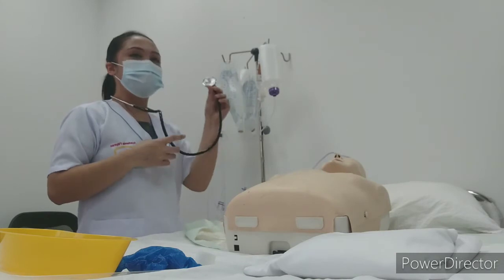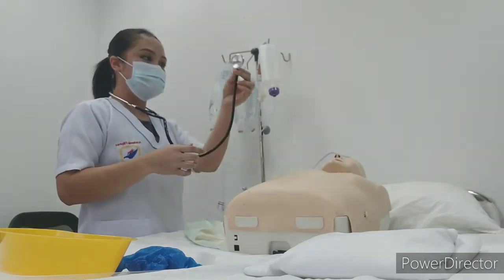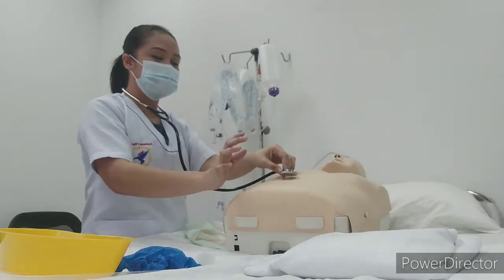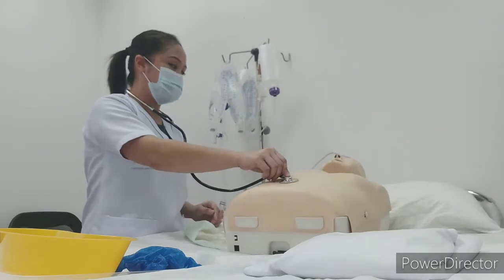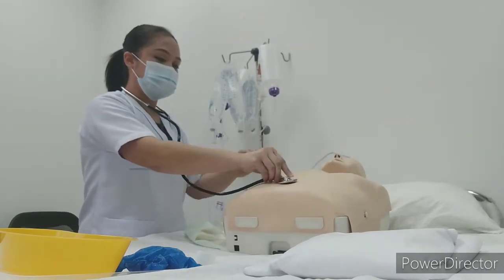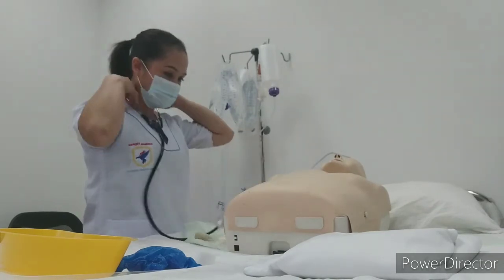So we will use the stethoscope. This is the diaphragm. We will put the diaphragm above or below the navel. So we will put it here above the navel, just above the navel. Where is the heart? Here.